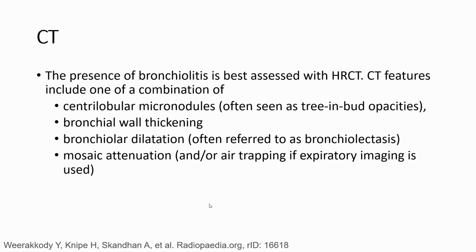So in CT, the presence of bronchiolitis is best assessed with HRCT. So we can find one of the combinations of centrilobular micronodules, bronchial wall thickening, bronchiolar dilatation, and mosaic attenuation.